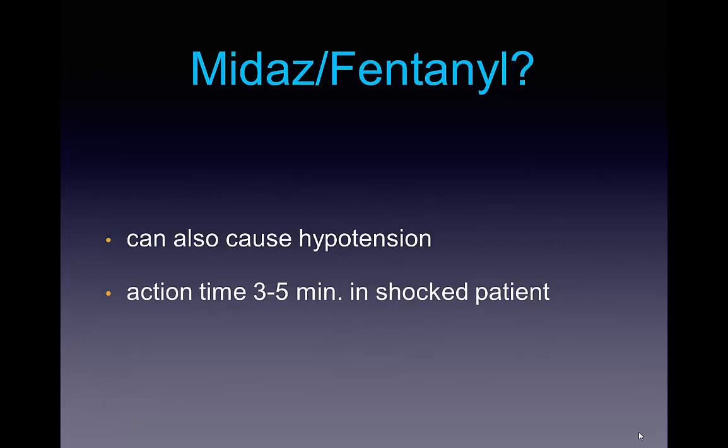Once again, a systemic agent can be given, again fentanyl, after you have given the Versed and waited, and once again, topicalizing that airway will allow the patient to tolerate all of this better.